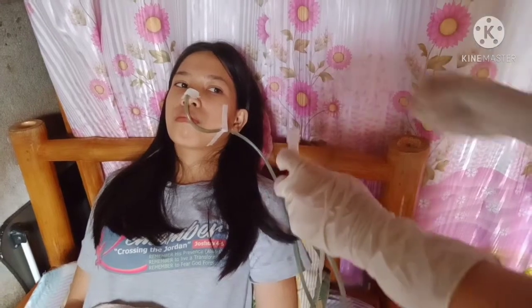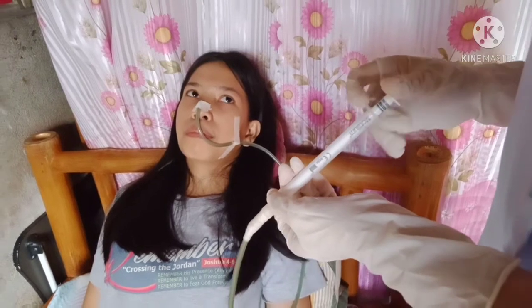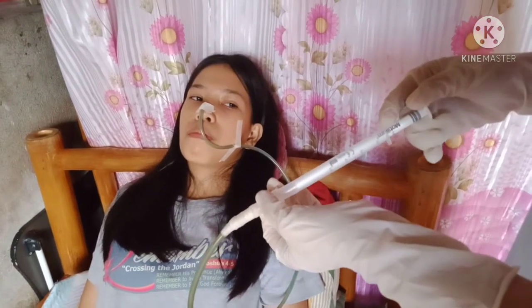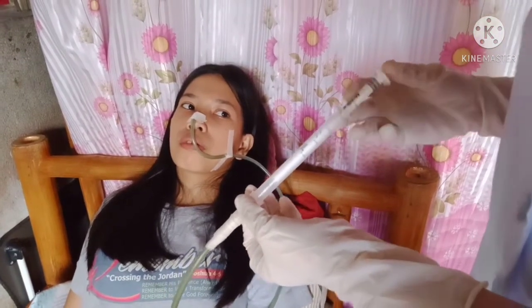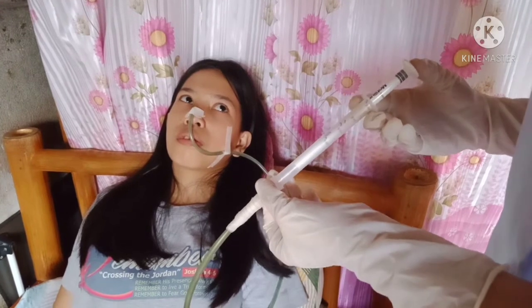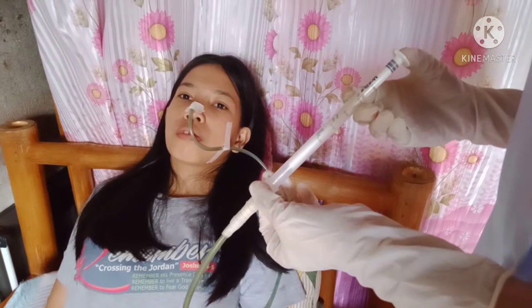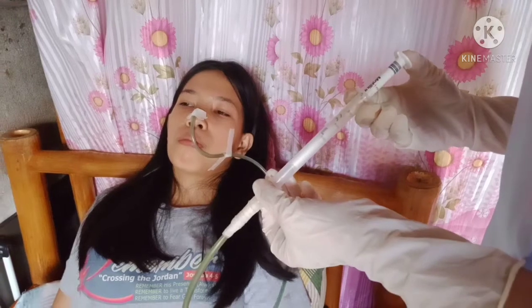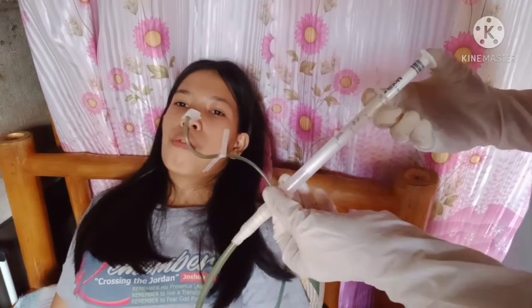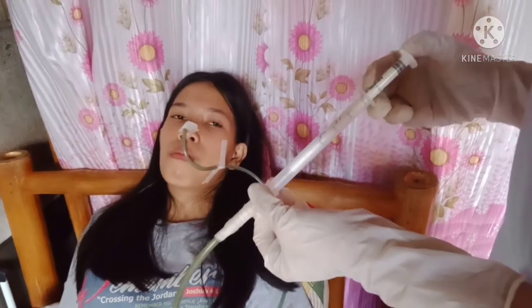Next, we have to determine tube placement. Aspirate gastric tubes to check for gastric residual, since the presence of gastric secretions indicates that the distal end of the tube is in the stomach. Residual volume indicates whether gastric emptying is delayed. So delayed gastric emptying may be reflected by 150 ml or more remaining in the client's stomach. So return aspirate contents to the stomach unless the volume exceeds 150 ml.